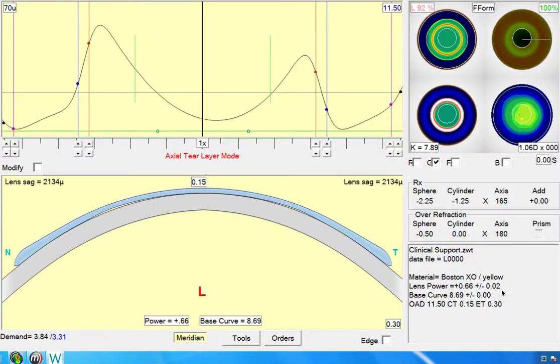In this demonstration, we're working with a patient where we suspect the refractive error has increased. The patient is taking minus power over the contact lens, and there's also some residual cylinder in the post-treatment refraction. And the post-treatment topography shows some incomplete closure of the reverse zone.